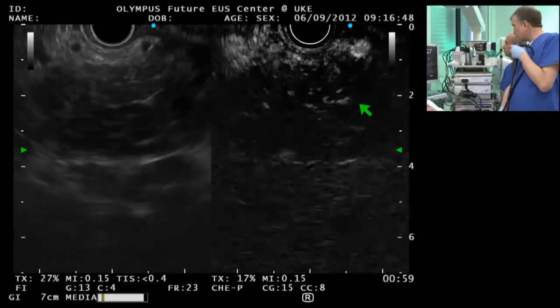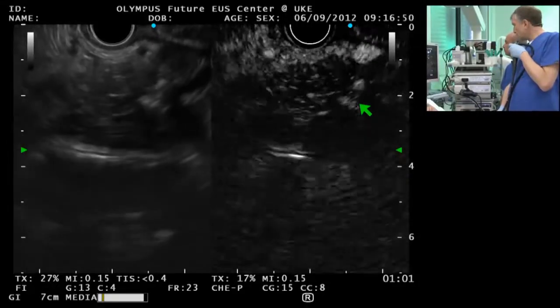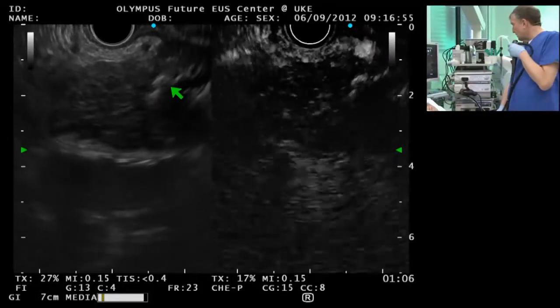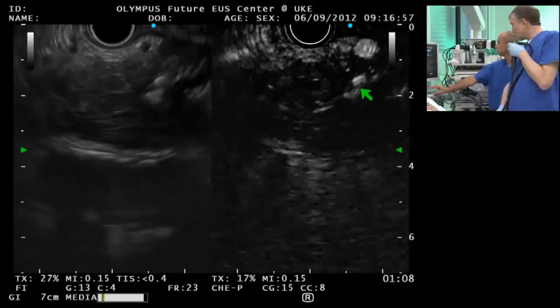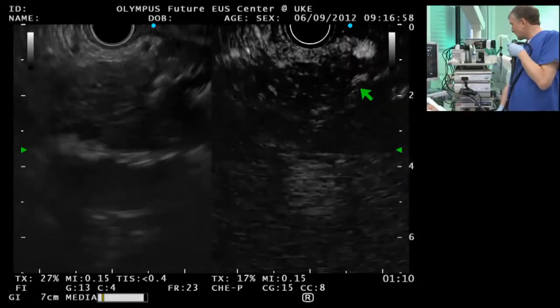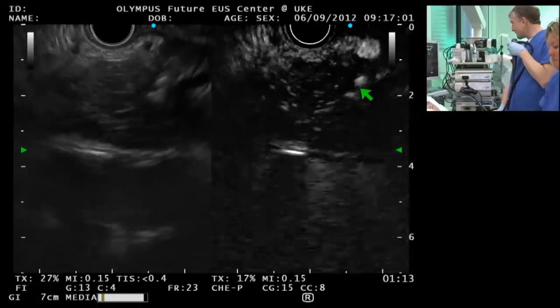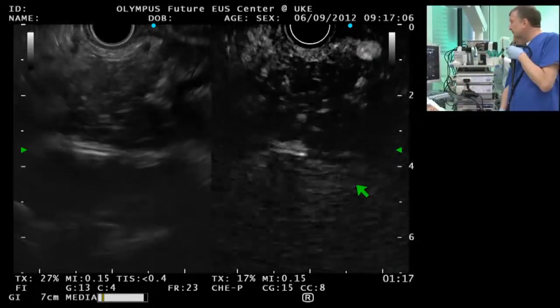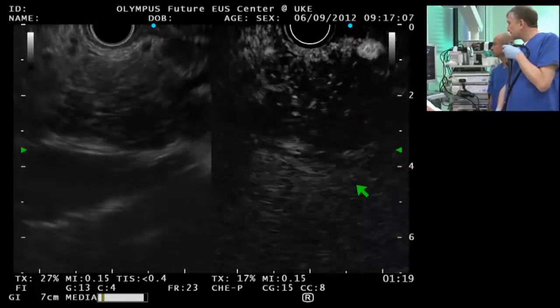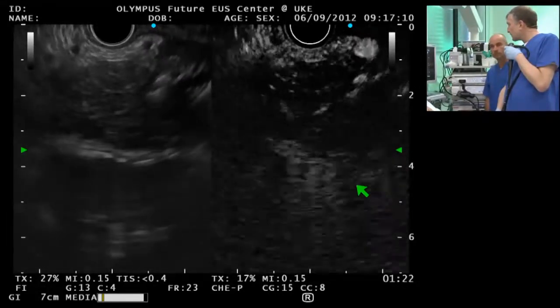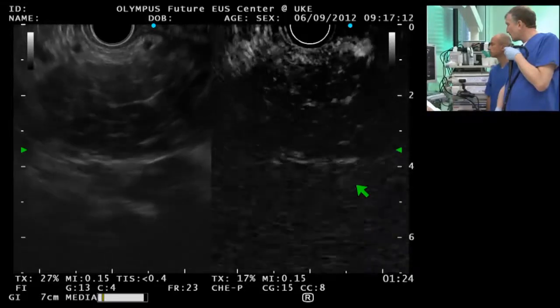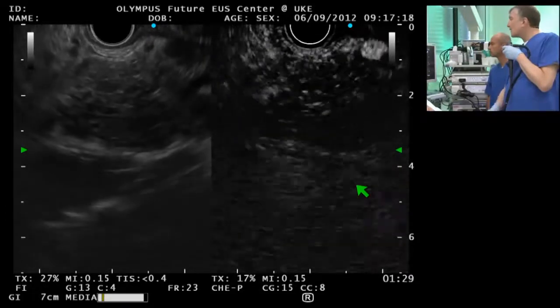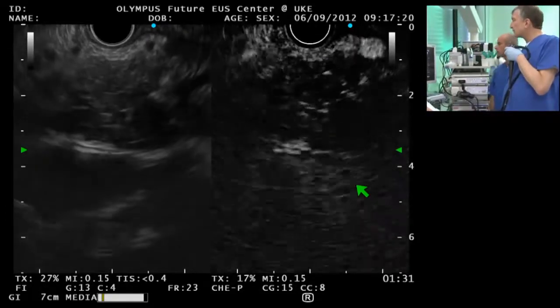Which we were considering. On the left side you see exactly where I am. You see even the stones on the right side. But there's no blood flow in a stone, sure. You clearly demonstrate the reason of the obstruction by the stone and also you rule out the tumor by the contrast — as far as we could. What shall you do next?